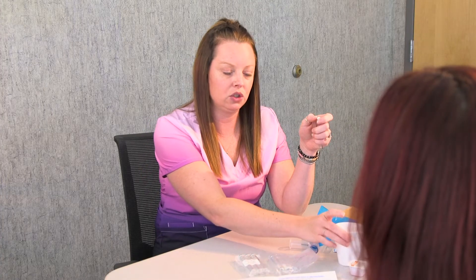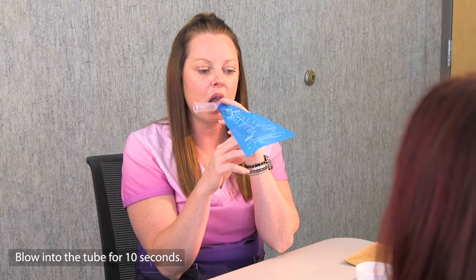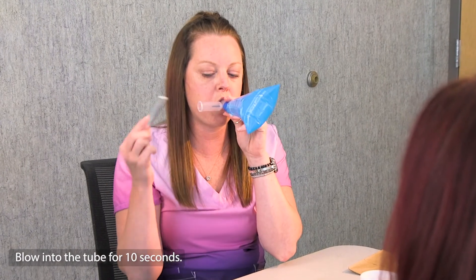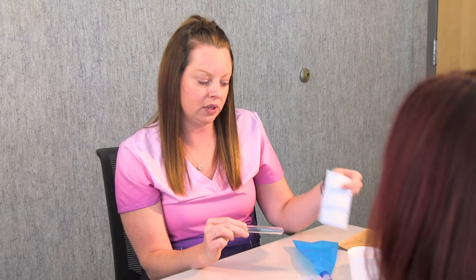I drank that, and now I'm going to blow into this tube after waiting 15 minutes — you're going to do the same. Blow into the tube the same way. Now you have your second sample done, and you will go ahead and label it just like you did the first tube.